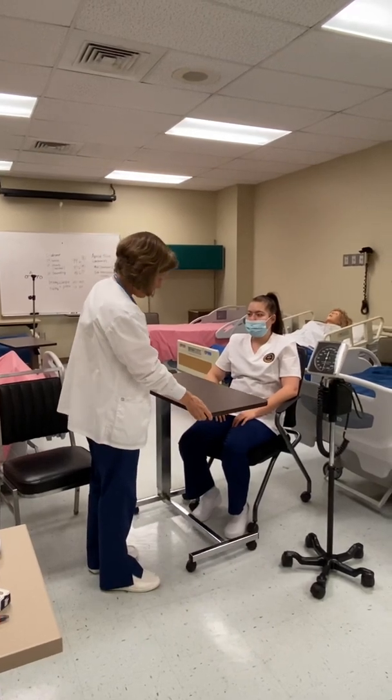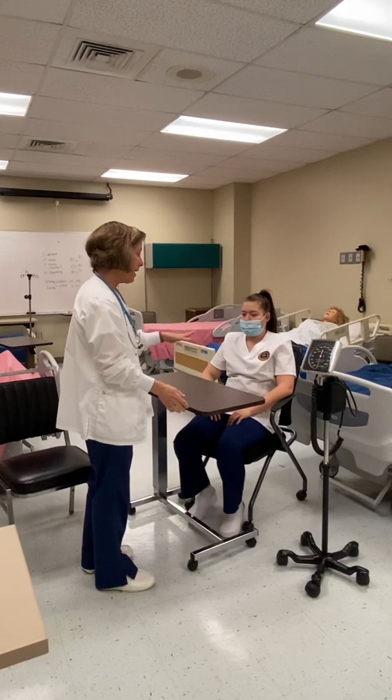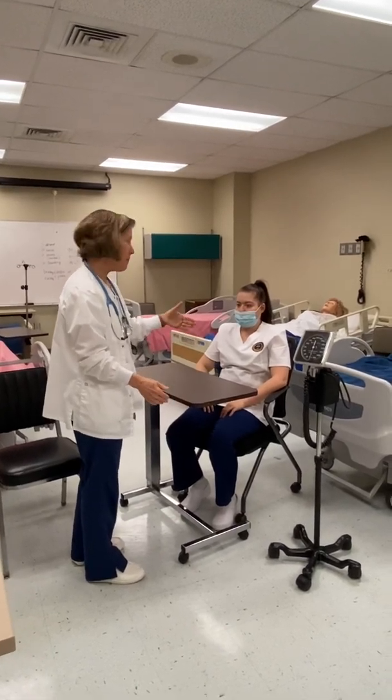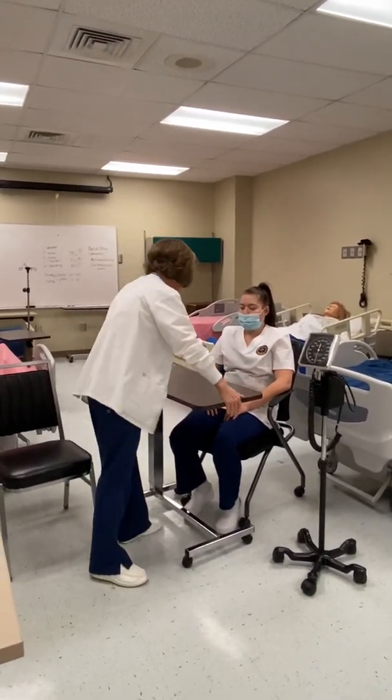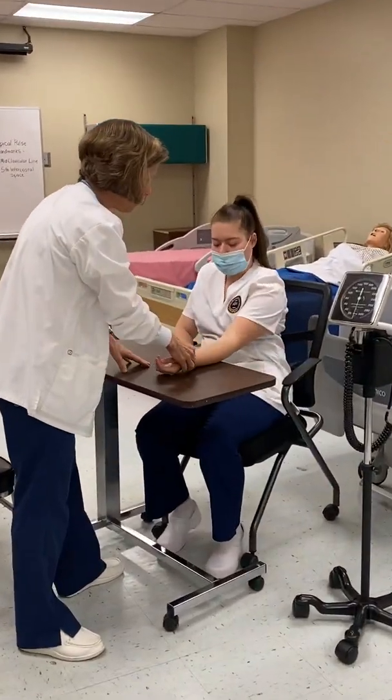I'm going to put the blood pressure cuff on and keep her arm at about the level of her heart. If I have an over-the-bed table, that works well — I can rest her arm right there.